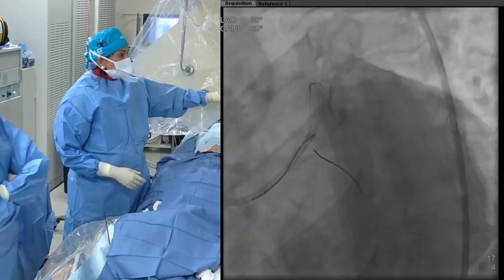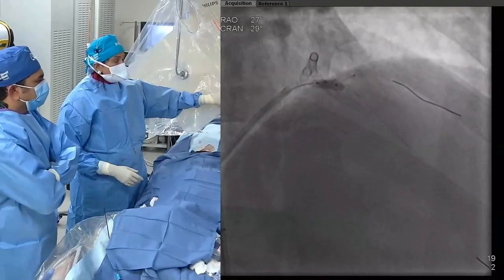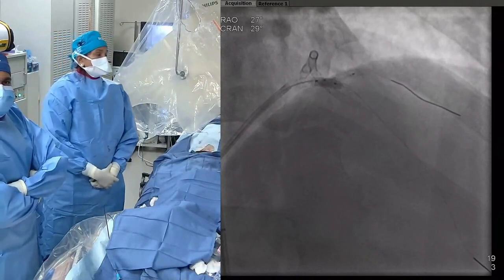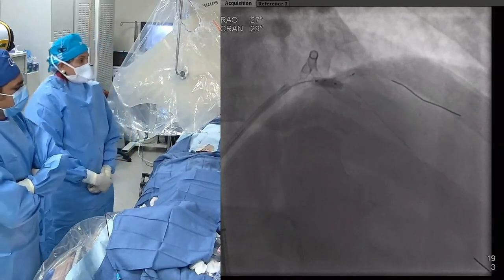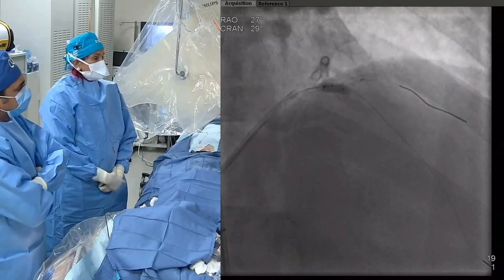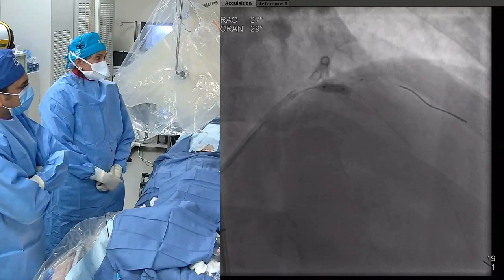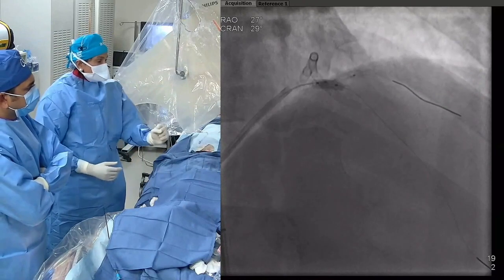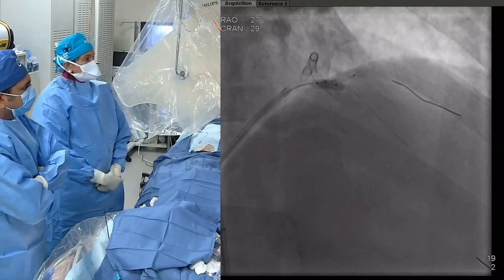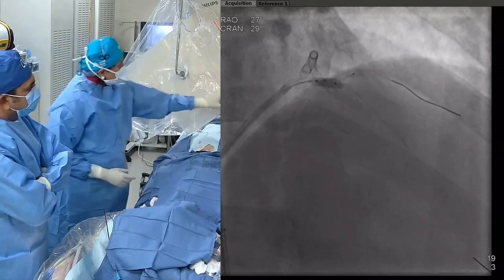Okay, you can change the audio to Dr. Kinney's room. Okay, yes, we see you. You left us after we did the IVUS, so the balloon would not cross into the diagonal, could be because of the angle also. So we did what is called a balloon anchor, where you take a 1-to-1 balloon of the main vessel, go distal to the side branch, and leave it there at about 8 to 10 atmospheres, and we were able to get the balloon across. We did the kissing balloon.